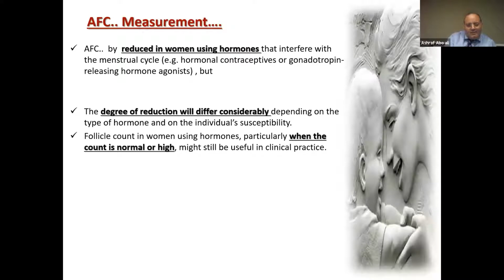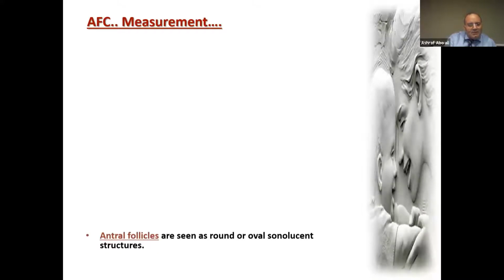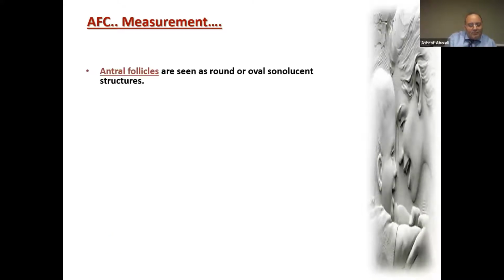When you are counting a normal or high responder, it is still useful in clinical practice to count, even if the patient is taking hormones, as it will not differ a lot. And maybe stopping the pills will not be an acceptable measure in some patients at some times. But this, of course, may be applied to some groups of patients.